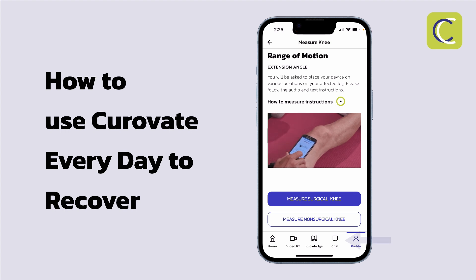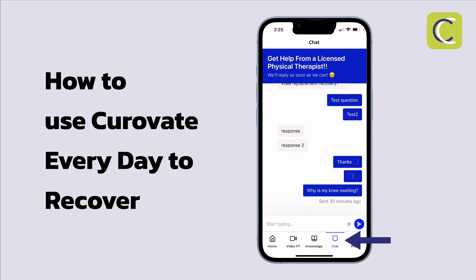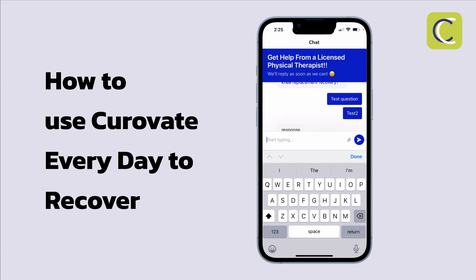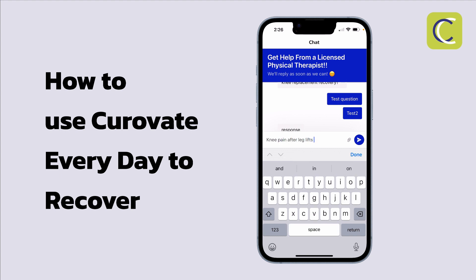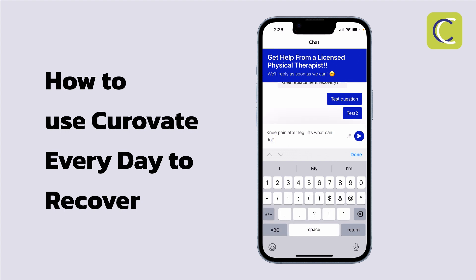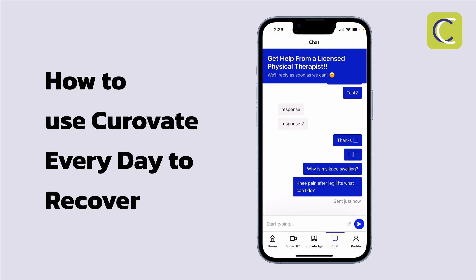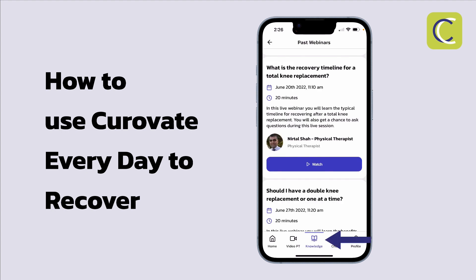If I have questions as I'm recovering, I can press on chat and ask a licensed physical therapist a question. For example, I want to know about knee pain after leg lifts. I'll ask this question and get a response from a licensed physical therapist about what I should do about my pain.